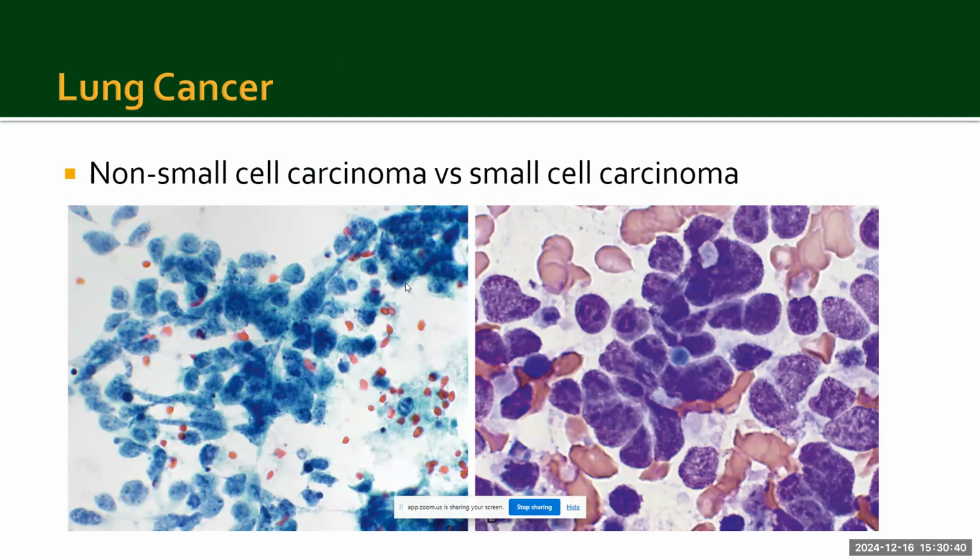So broadly, in very small cytology samples, our main aim is to distinguish whether it is non-small cell carcinoma versus small cell carcinoma. Why is it necessary to make that diagnosis? Because small cell carcinoma is associated with rapid progression, sometimes making the patient sick overnight and requiring definitive clinical intervention in a very short span of time. So that is my usual approach.